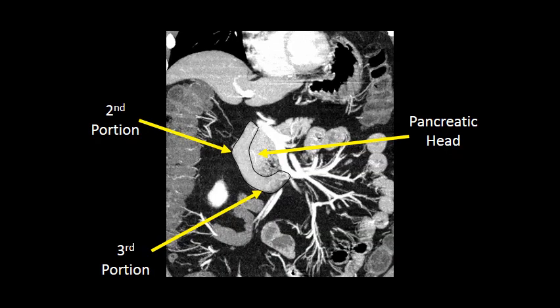As we move down, we can now see the second and third portions of the duodenum in their retroperitoneal position, creating the C-loop. The pancreatic head fits in along the second and third portions of the duodenum, as it is also a retroperitoneal structure. The common bile duct passes through the pancreatic head, joining with the pancreatic duct to empty through the ampulla of Vater into the second portion of the duodenum. A periampullary duodenal diverticulum can commonly be seen impressing into the head of the pancreas — a common phenomenon, though rarely clinically significant. It can be mistaken for a pancreatic mass if there is no gas within it and it appears fluid-filled and heterogeneous.